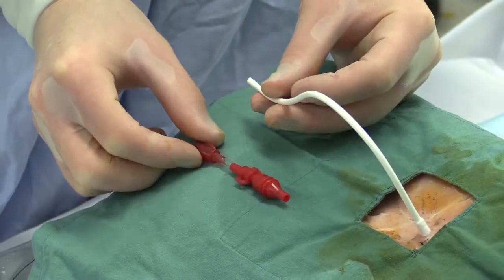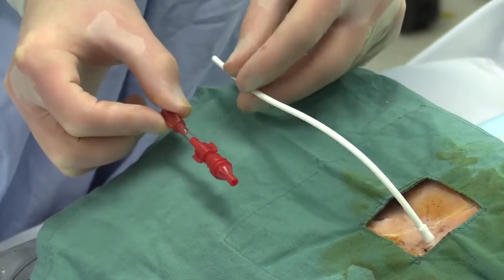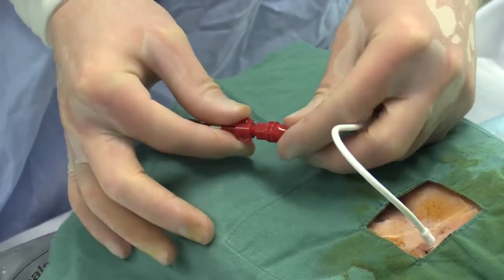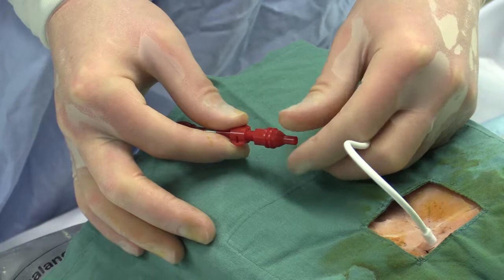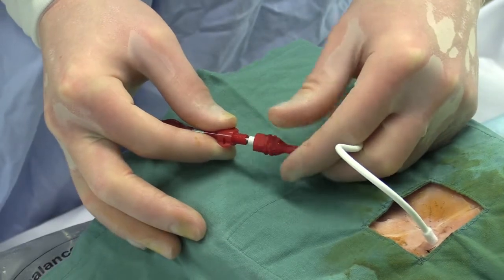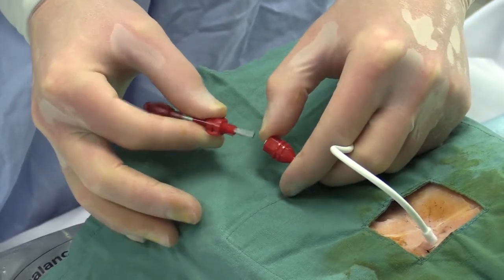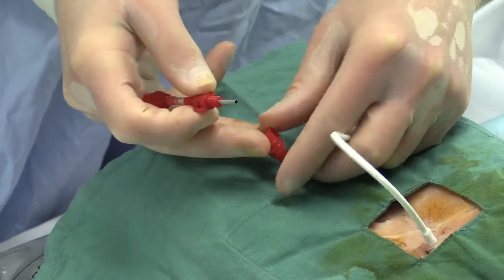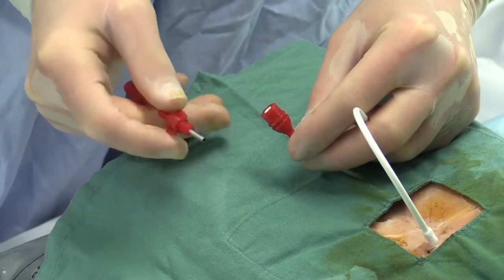And then the next stage in our assembly is the catheter adapter connection. This catheter adapter comes in 2 parts, and they are screwed together. So we will need to unscrew the distal end of this catheter adapter. It has a metal tubing on the one side and a bullet-shaped cap on the other.